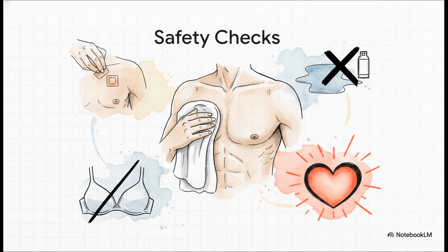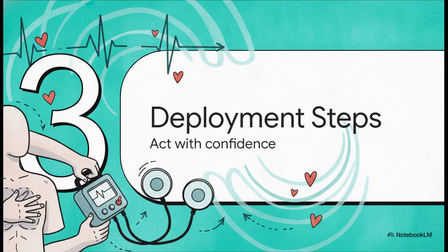And for pregnant patients, well, the protocol here is to treat a pregnant patient just as aggressively as anyone else, because the absolute best way to ensure the survival of the baby is to save the mother. All right, Section 3, step-by-step AED deployment.